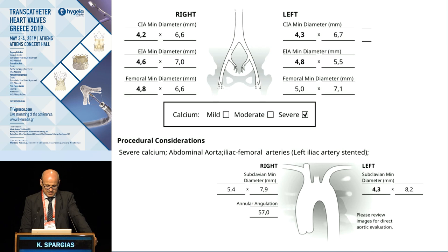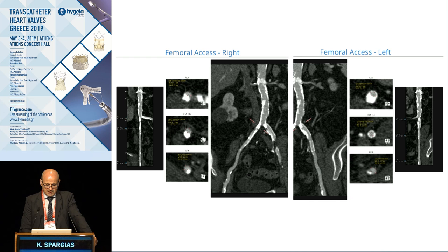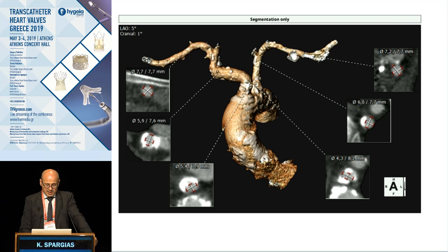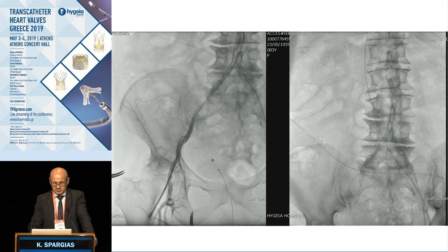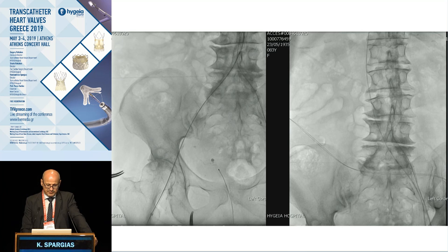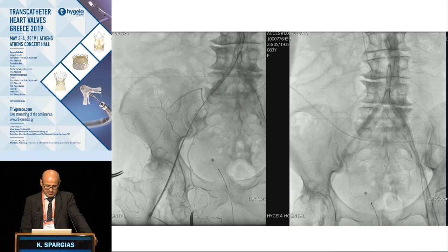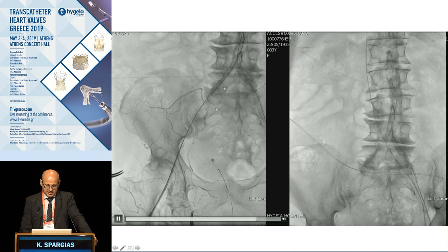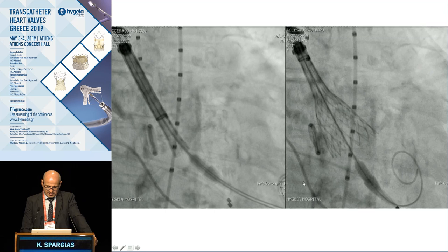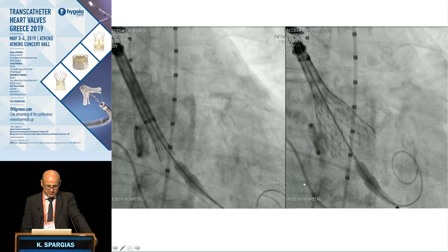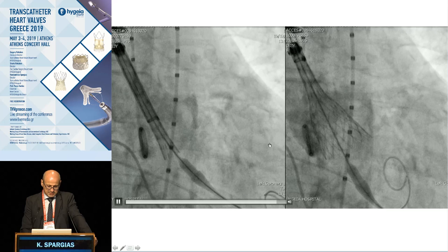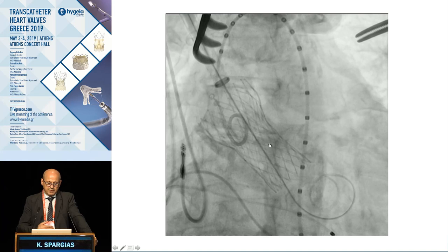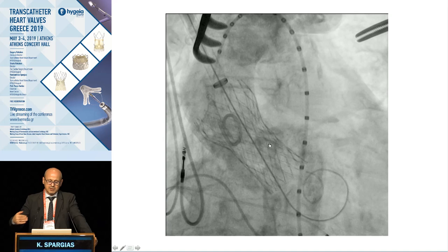This is another case with very small peripheral arteries, a lot of calcification, and problems with other access routes — the subclavian was not acceptable and there was calcification in the thoracic aorta. We gave it a try from the leg. Despite appearing feasible, we were unsuccessful in getting in from the leg despite trying with the E-sheath for a long time. We converted immediately to transaortic and implanted an Evolut valve successfully. This demonstrates the advantage of having all access options available simultaneously, with the full team present — you can try borderline cases and if transfemoral fails, the patient still gets a valve from another access.